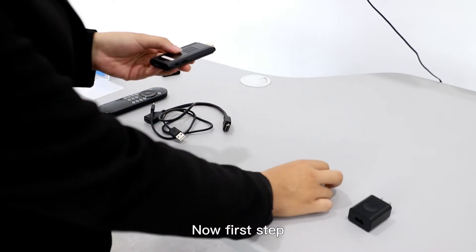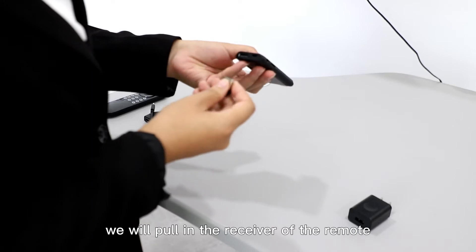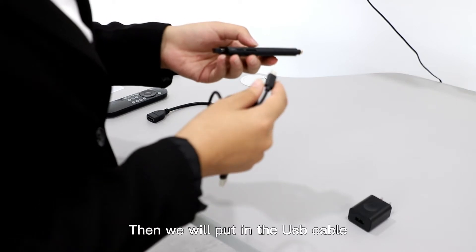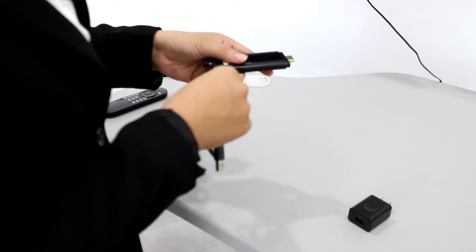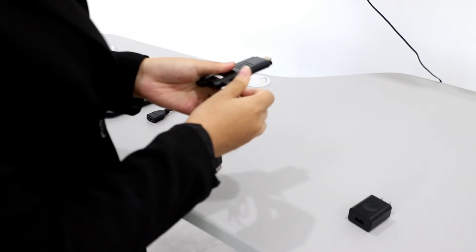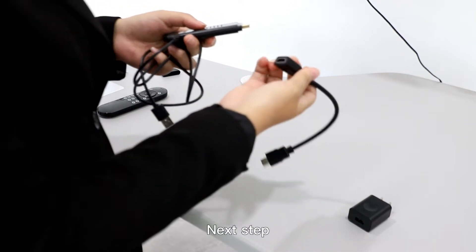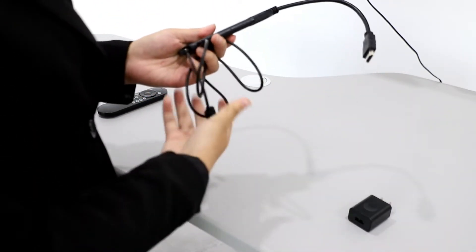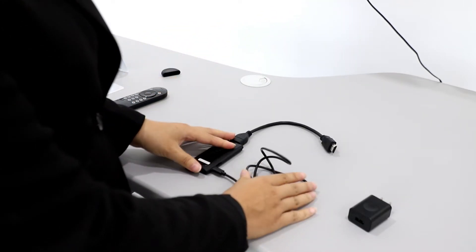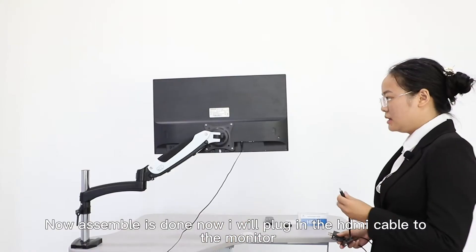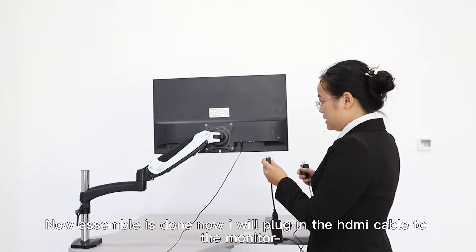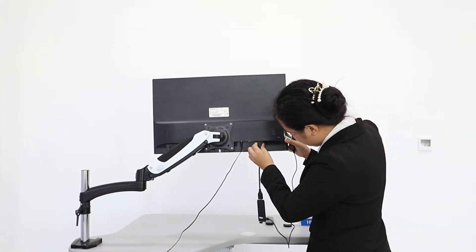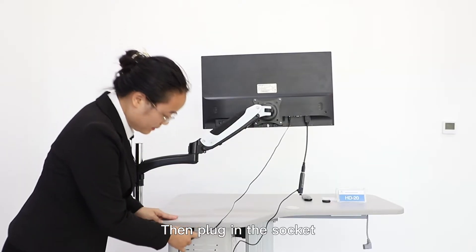Now first step, we will plug in the receiver of the remote. Then we will plug in the USB cable. Next step, plug in the HDMI cable. Now the assembly is done. Now I will plug in the HDMI cable to the monitor, then plug in the socket.